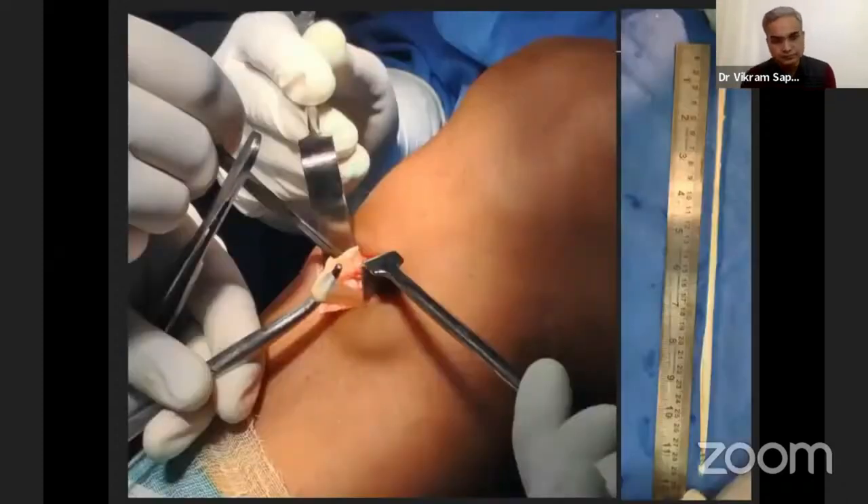For graft harvest, I prefer an oblique incision around 5 cm below the joint line. In thin patients, you can palpate the hamstring tendons directly. After the oblique incision, the cylindrical tendon you palpate is gracilis, and below that is semitendinosus. We go between the two, cut the sartorius fascia, fish out the semitendinosus with a stripper, cut off all vinculum attachments, and take off the periosteum to add about 1.5 cm of length — which also improves ligament healing.